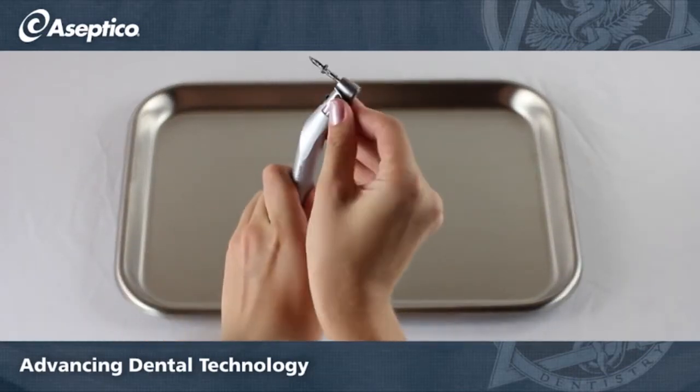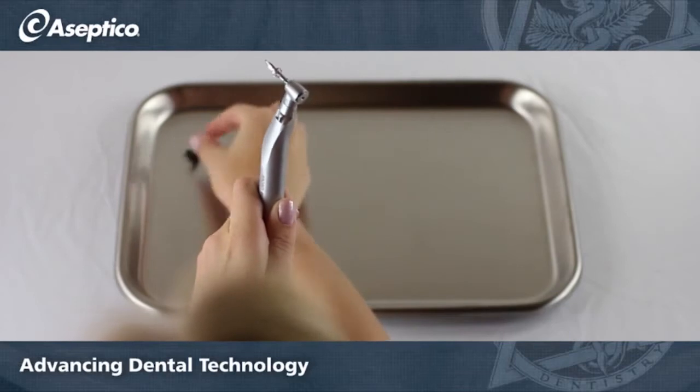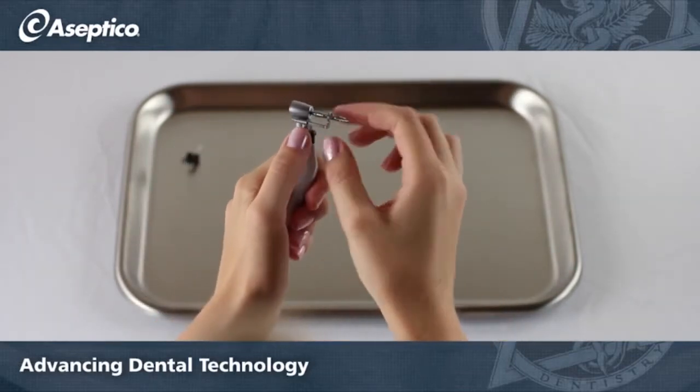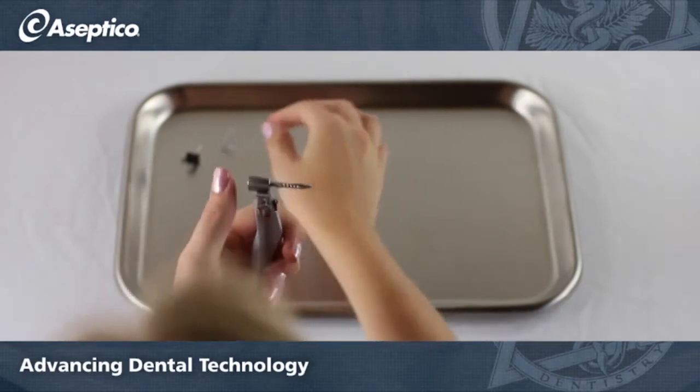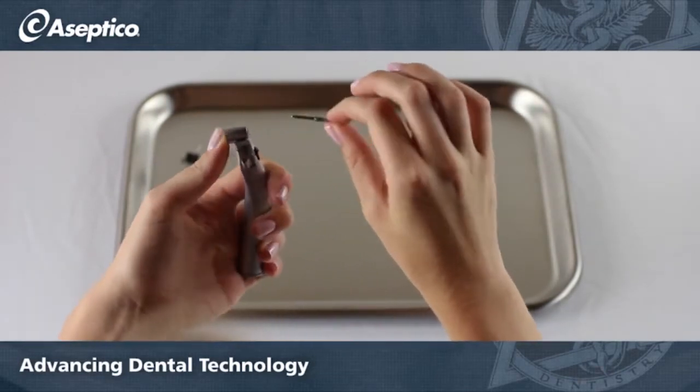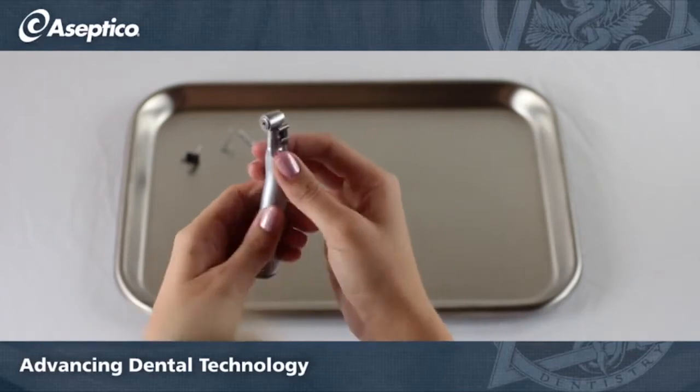Let's start by removing the irrigation clip — it snaps right off. To remove the depth stop, press down on the adapter lever to pull the depth stop out. The burr will release when you depress the button on the back of the head of the handpiece.